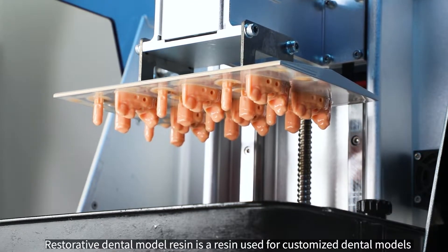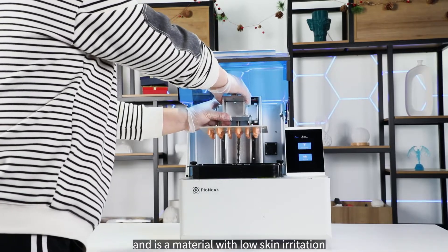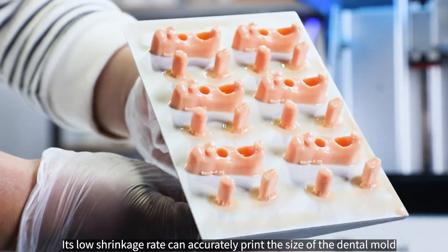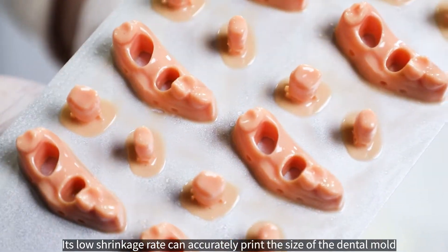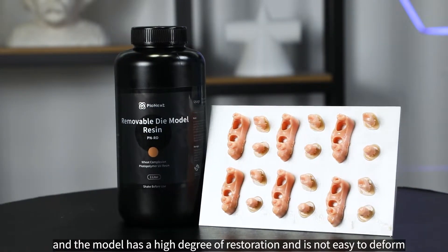Restorative Dental Model Resin is a resin used for customized dental models and is a material with low skin irritation, allergy and biocompatibility. Its low shrinkage rate can accurately print the size of the dental mold, and the model has a high degree of restoration and is not easy to deform.